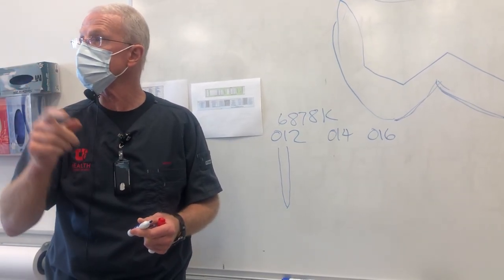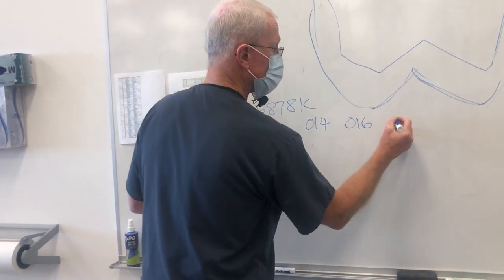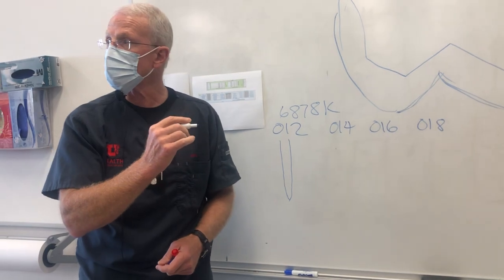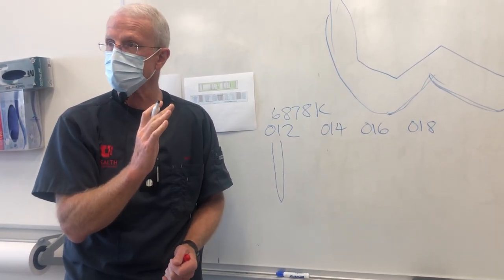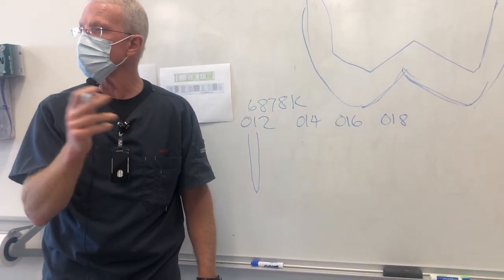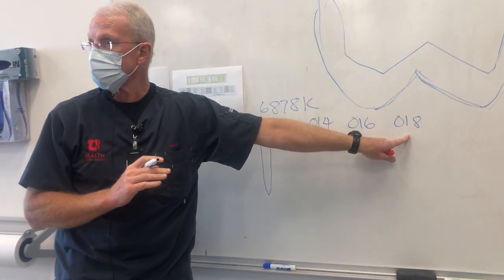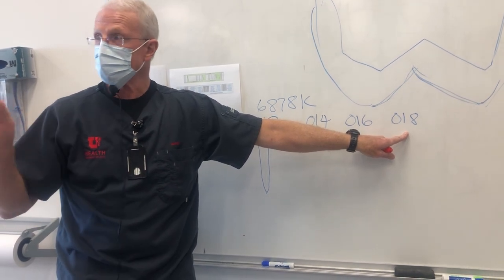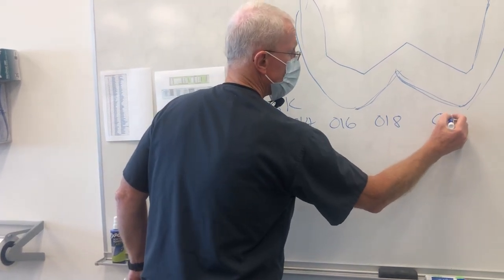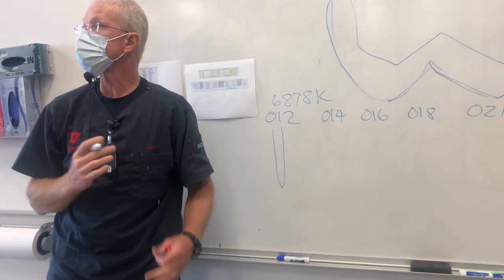over on the cart. So you can use an 016. And what's the advantage of the 016? Well, it's a little smaller diameter than the one that's on your burr block, which is an 018. And so interproximally, if you want to drop it down to an 016, it gives you just a little bit more room. All of the preparations that I've done, that I show you, I do them with the 018 only. So you can do everything, including interproximal, with the 018. Brasseler even makes an 021. That's huge. That would obviously be too big.